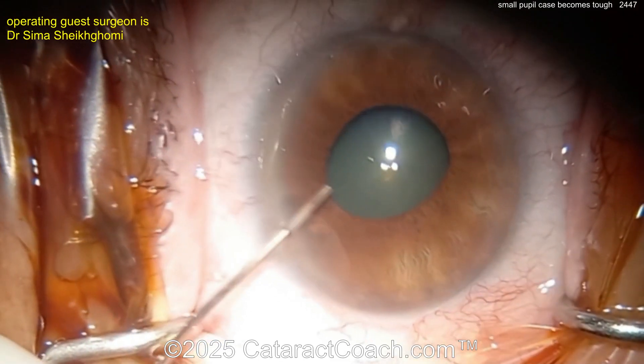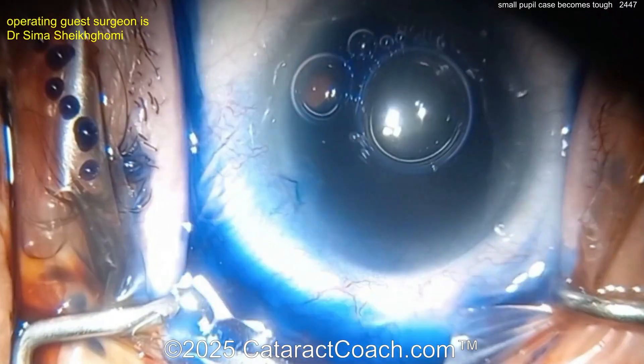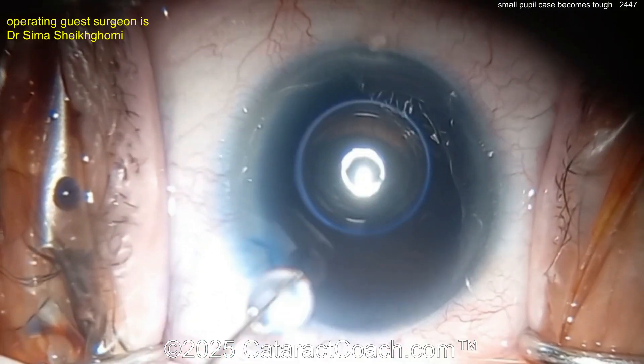Now going in with some BSS or epinephrine, and now trypan blue dye going inside the eye.